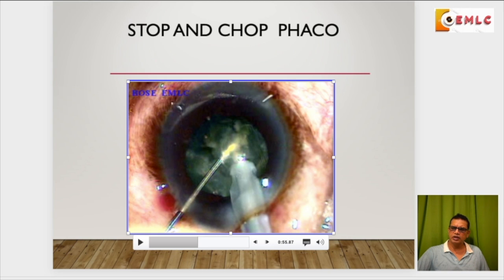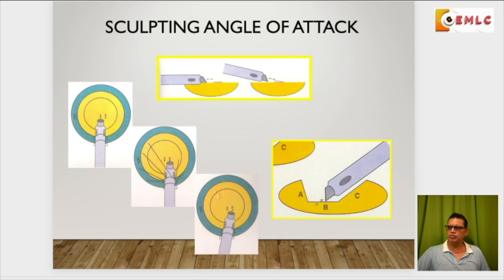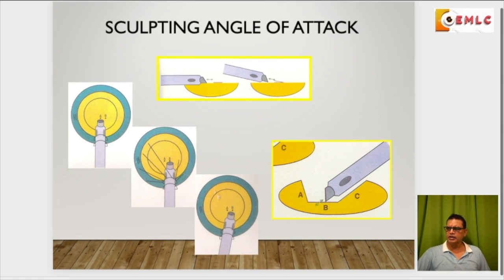Now, a few words I'd like to say before going to the Phaco chop. While sculpting, your Phaco tip or handpiece should not be parallel to the nucleus.